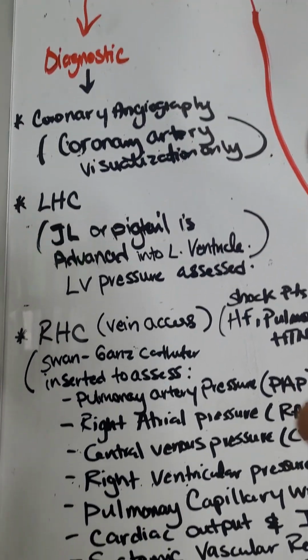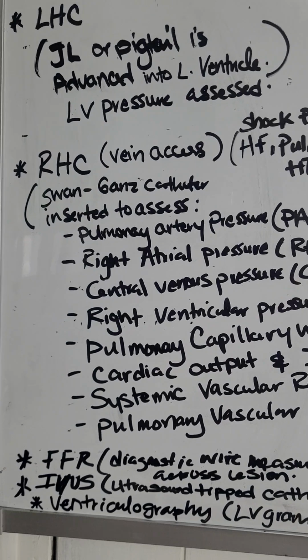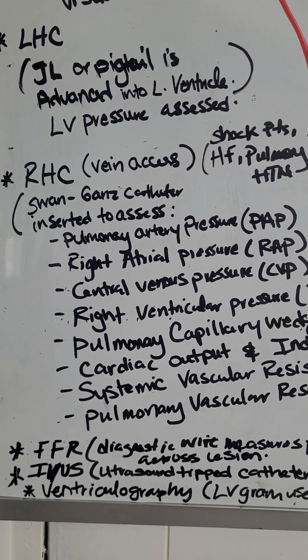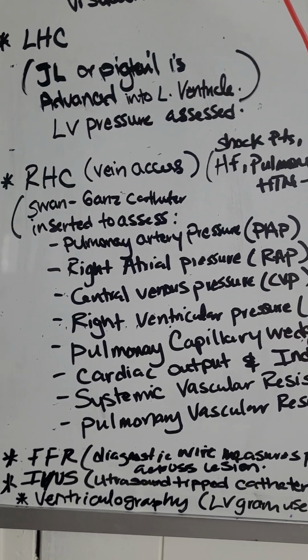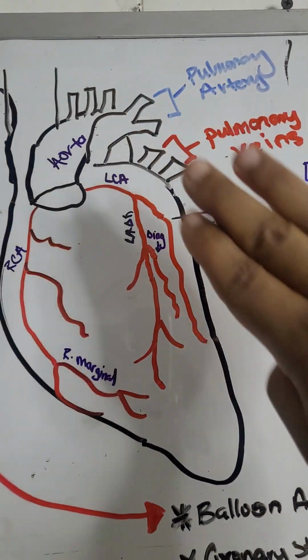Good? Okay, so let's go to the next thing we do. The next diagnostic testing that we do in the cath lab is called a right heart cath. Just like the name, we're focusing on the right side of the heart, right? So right heart cath, the right side of the heart, it will be on this side, okay?